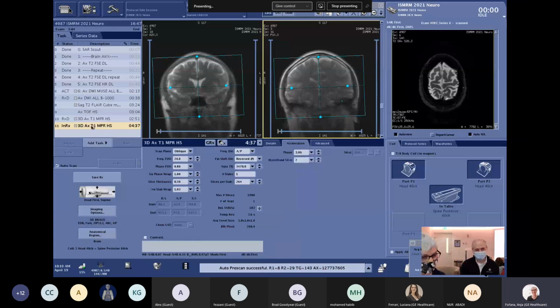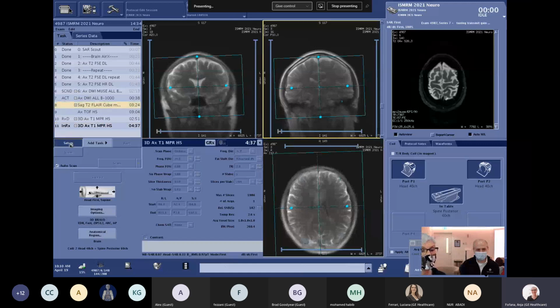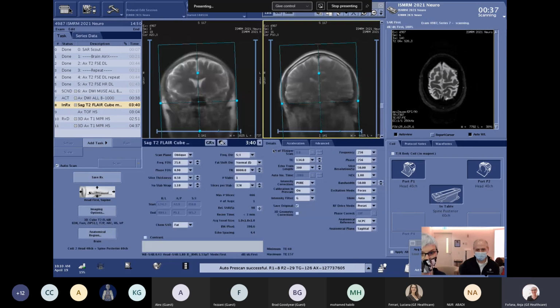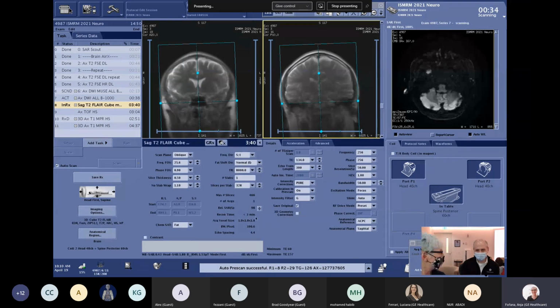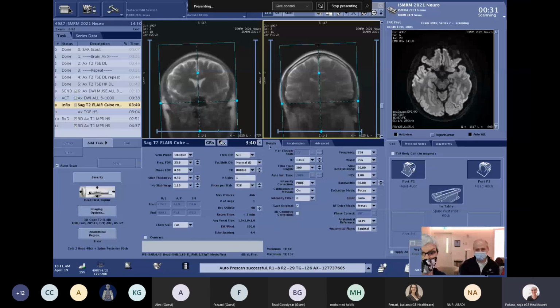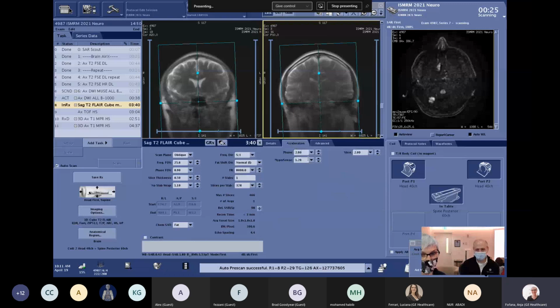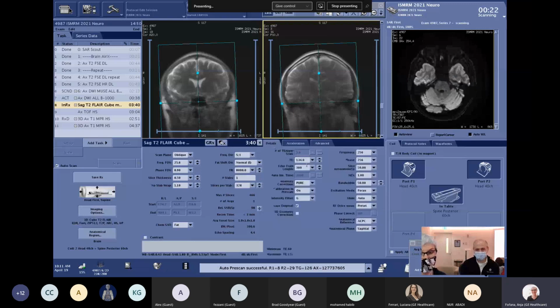Yep. And just to show you other options for HyperSense. We don't have to scan it, but just to show you how you can optimize your 3D Cube sequence. Here's an example for the FLAIR. So the FLAIR is done with FatSat and Cube. Let me just open that up for a second. And here you can see, again, really good resolution with 1 millimeter. And we have a scan time of only 3 minutes and 40 seconds because, again, HyperSense is selected here with a factor of 1.2. But on top of HyperSense, we have HyperCube also available on these Cube FLAIR sequences.